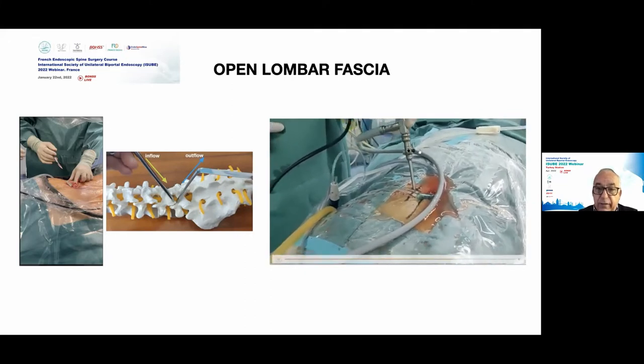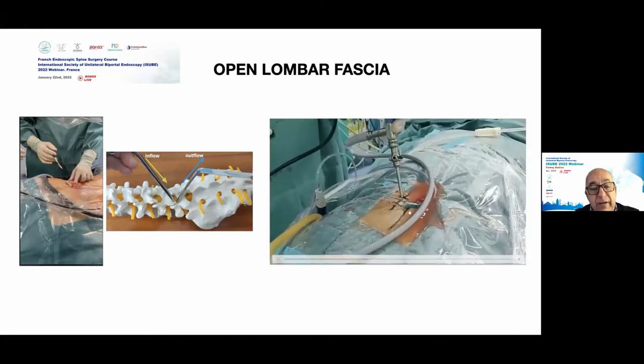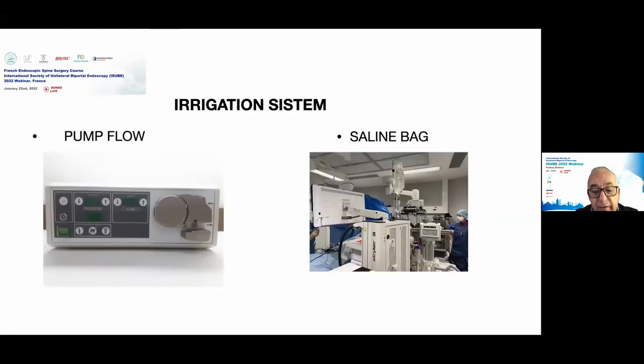Another point is the irrigation system. In my first surgery, I used saline solution bags, controlling the pressure through gravity. However, I now use the infusion pump. Why? These pumps allow us to increase or decrease the flow of liquid during the surgery. And what is the advantage?